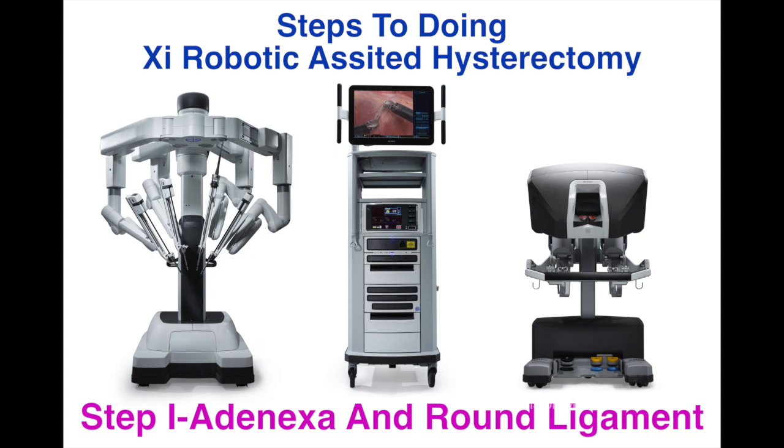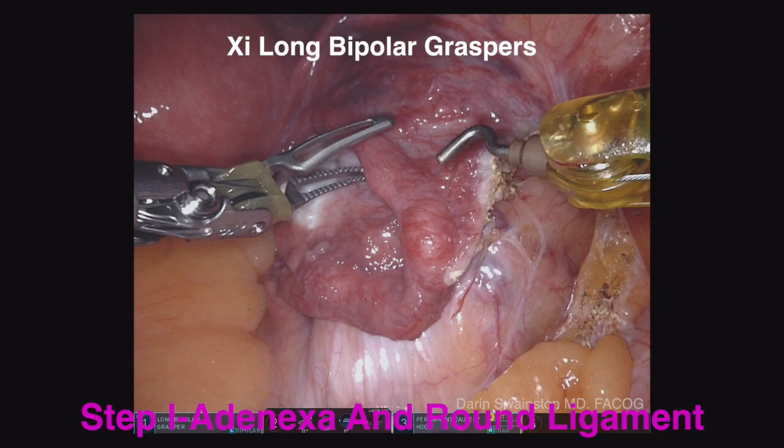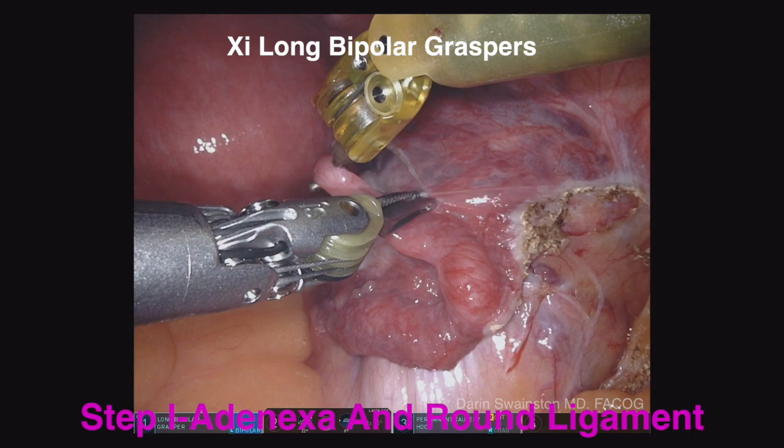I've divided XI robotic hysterectomy into five or six separate segments. Step one is the adnexa and round ligament, and it starts by first taking the salpinx by grabbing in the middle of it and pulling up.